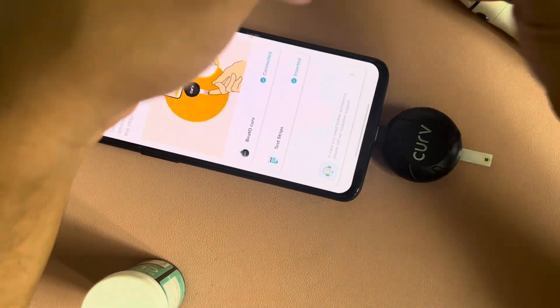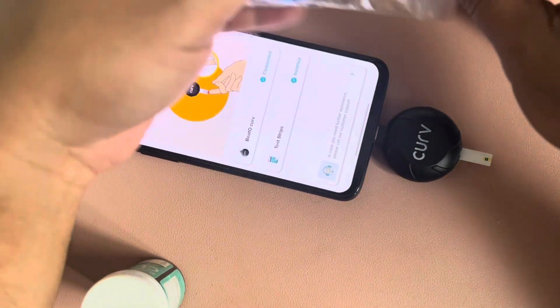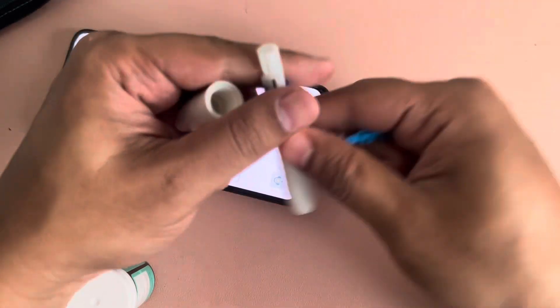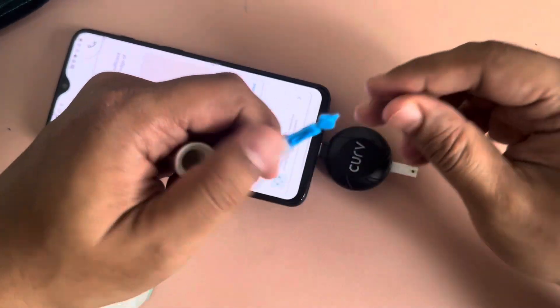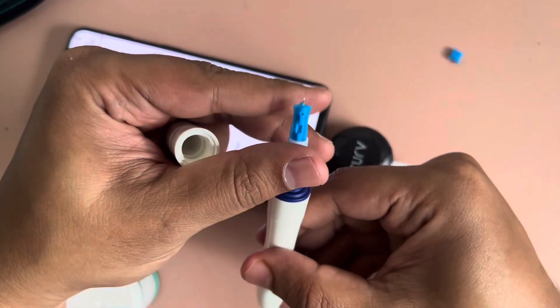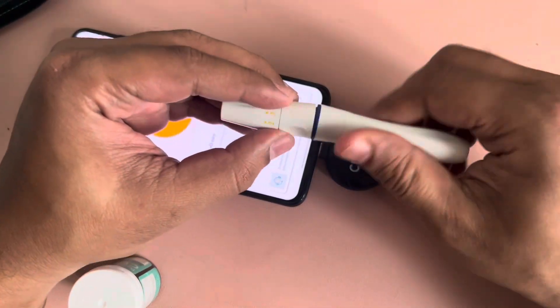Next thing is you need to take one lancet. Open the lancing pen and place the lancet inside it, then remove the top part of the lancet where there is a little sharp needle. Then just close this.